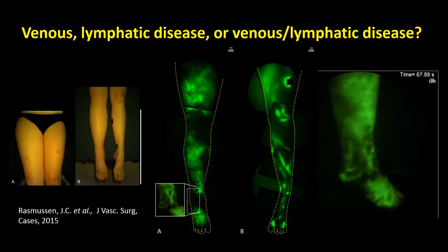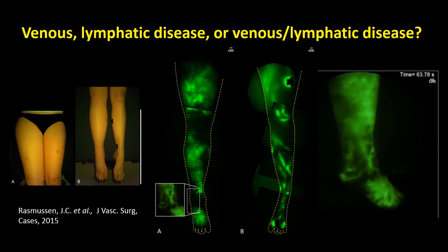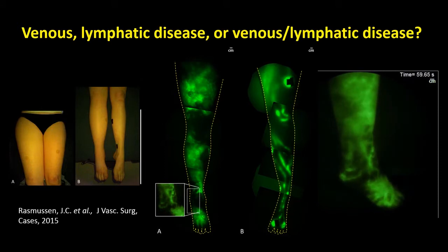Interestingly, when we look at the ankle, we can actually see that dermal backflow, but deep in that ankle, we see that functional lymphatic vessel pumping. So there's hope that we can basically get those lymphatic angions working again so that we can create the sufficient pressures that move lymph distal to proximal and get rid of that dermal backflow.